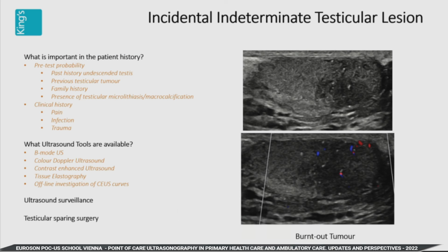80% are benign. But you as a radiologist, and this is the only time a radiologist ever actually speaks to a patient, I know you're all clinicians here, but the radiologist sits in a dark room with CT scans and never sees a patient until they retire and become one. You are going to speak to the patient, and the ultrasound couch is like a psychiatrist's couch. It's a dark room, you're putting warm jelly on, and you're talking to the patient nicely.